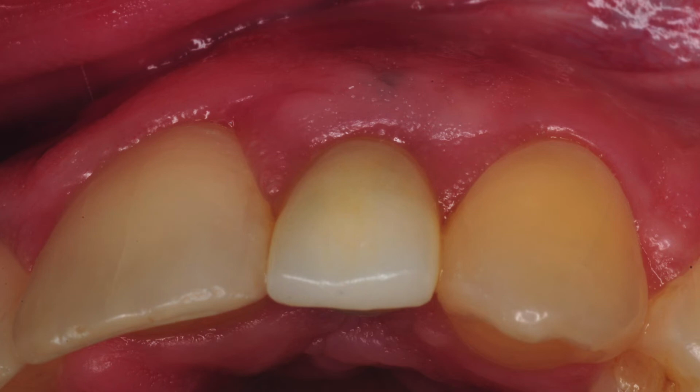So it's interesting that we see the abundance of the soft tissue and bone translate into what clinically and aesthetically this case resulted in. This is really interesting. Root eminence. Something we have also appreciated more and more over the years, and there have been a number of papers on this, is the effect of the thickness of the soft tissue on the longevity and stability of the tissues, and the survivability of the implant. We won't get a fenestration, we won't get a dehiscence, we won't have peri-implantitis. The whole complex has stability because of thickness.